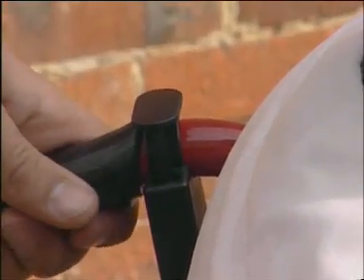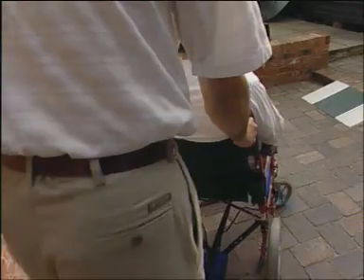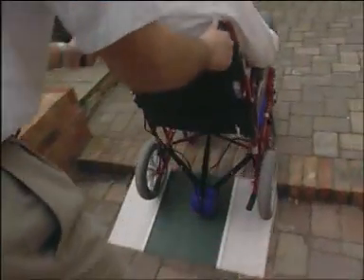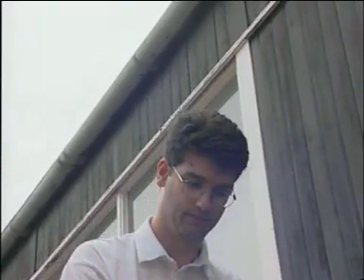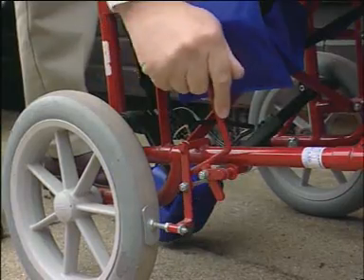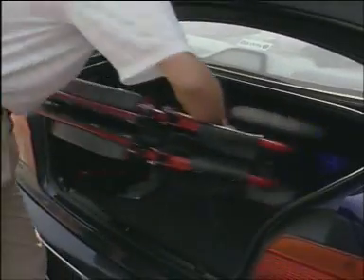So how does it work? The attendant turns the trigger, fitted to the left handle, to the on position, then lowers the drive wheel to the ground using the lifter on the strap attached to the right handle. The attendant presses down on the trigger and simultaneously starts pushing — the Sinclair WDU begins to assist almost immediately. Conversely, if the attendant releases the trigger, power cuts immediately. When bumping up a kerb or step, the WDU is raised using the lifting strap. If the WDU isn't needed for a time, it's simply parked by placing the trigger in safe mode, or folded away — most typical folding chairs will still fold, even with the unit installed.